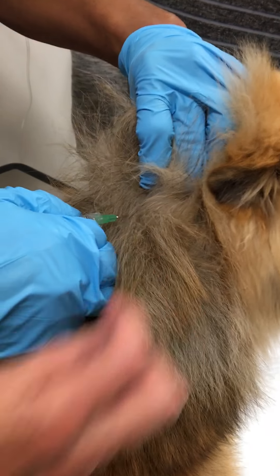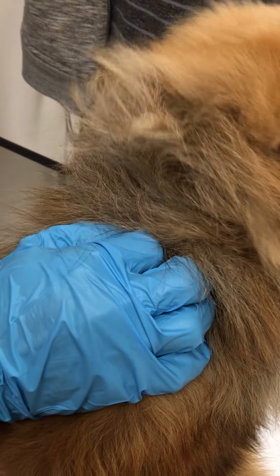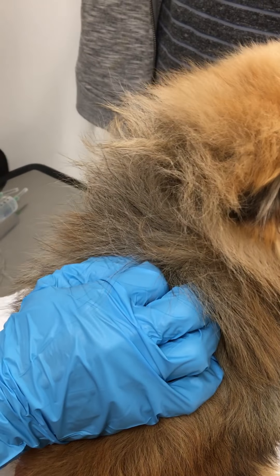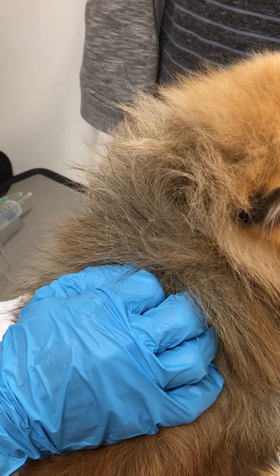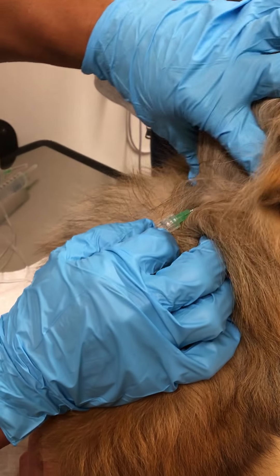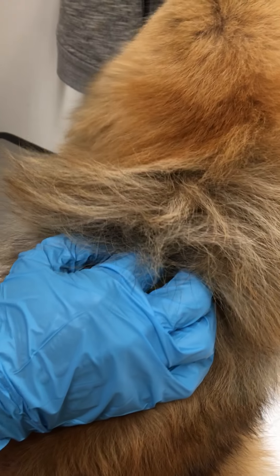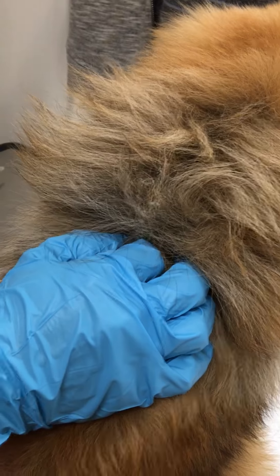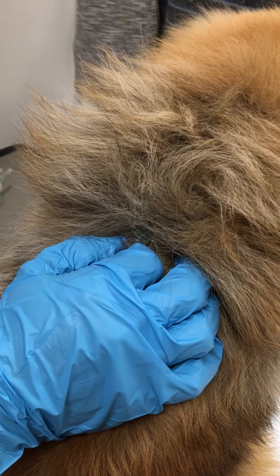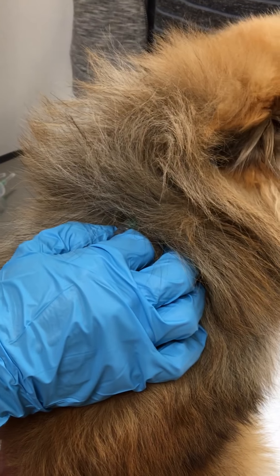There's a tent that he puts on. Oh, my God. You're so good at this. Don't tell anybody. Dr. Schmidt. Come on, you know it. I can't believe it. That's a good drug. She was freaking out when she did it. And he's just like, piece of cake. So now let's look for any leakage. No leakage. We're doing a good job here. Now we need to go to 100. If you want to do it faster for any reason, you can actually apply pressure. I like what's going on. He doesn't even know what's happening. You are a genius. You're good at this. It's just a little skill.